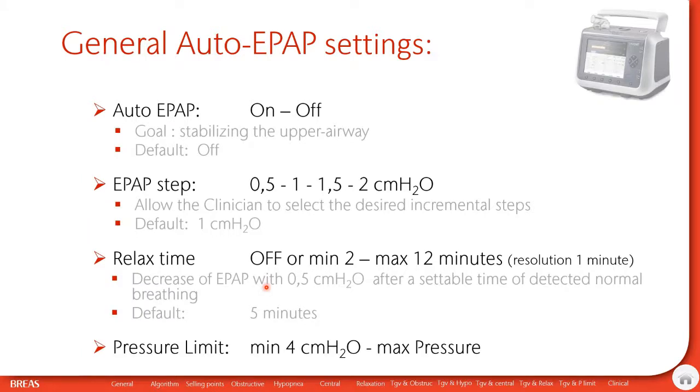And then there is something which is called the pressure limit. The pressure limit, as we will see in one of the next slides, is a new setting which will indicate the highest pressure allowed during auto-EPAP treatment.